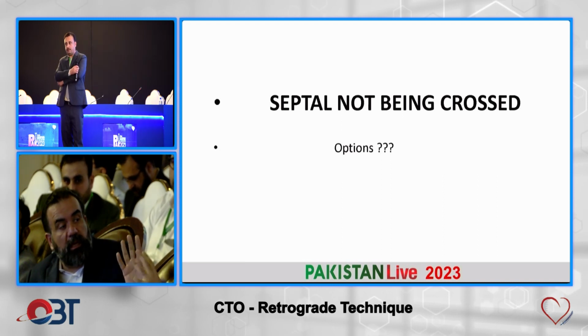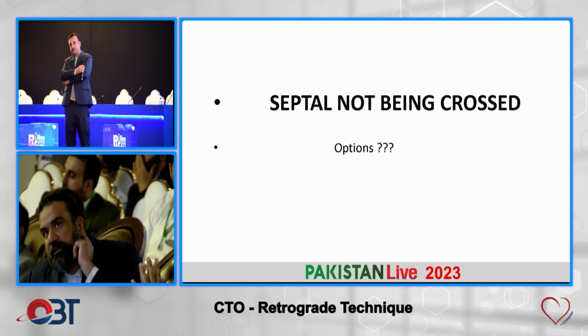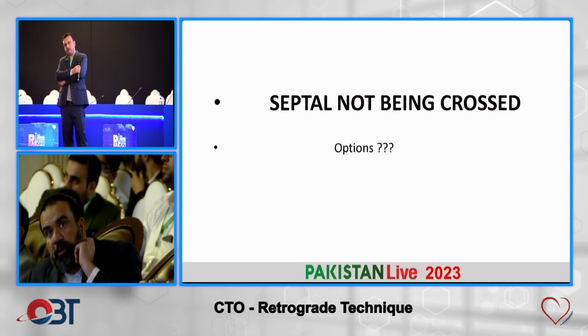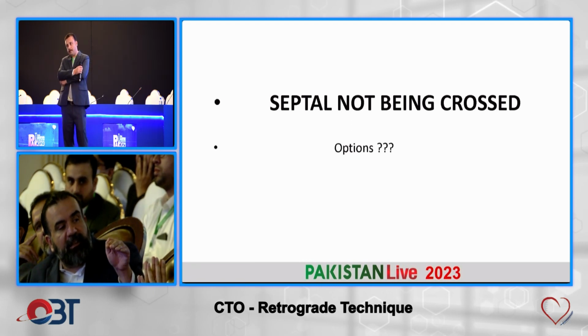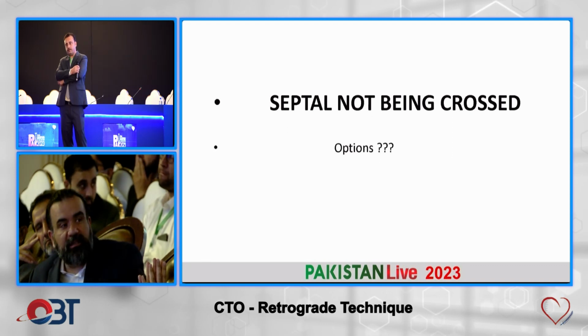So, with a good septum to the RCA, if we are talking of anything, what would be your approach? So if the disease is there, sometimes septals are diseased, you can angioplasty that with a 1.0 balloon or a 2.0 balloon, but more often than not, the problem is you've already fixed the area, there's a stent there. Then you get the wire through there, and you can't get the microcatheter. So in that case, I will put a balloon there, open up that ostium and the stent strut, and then get the microcatheter and then use one of these techniques.